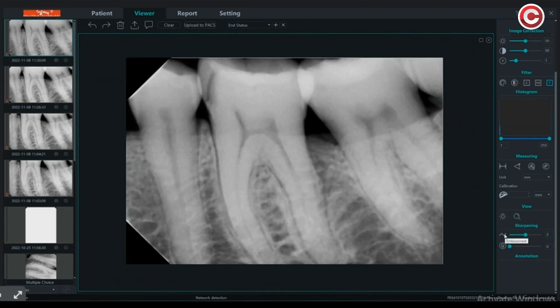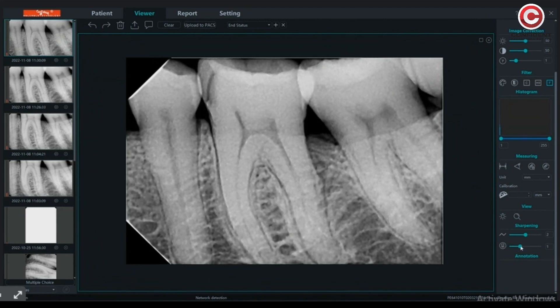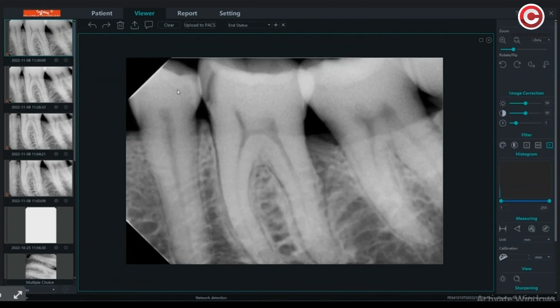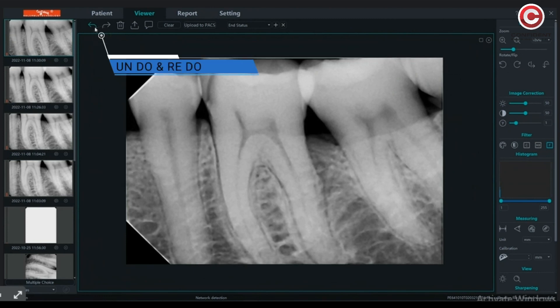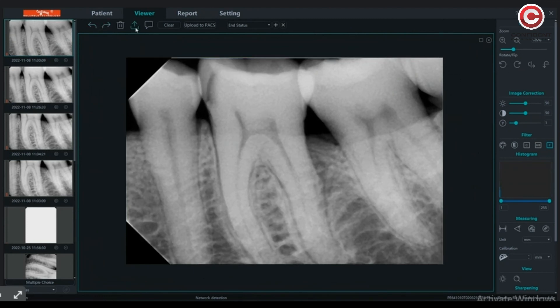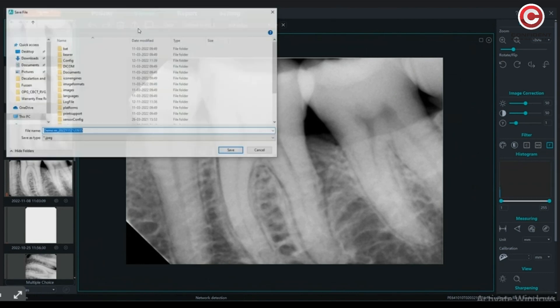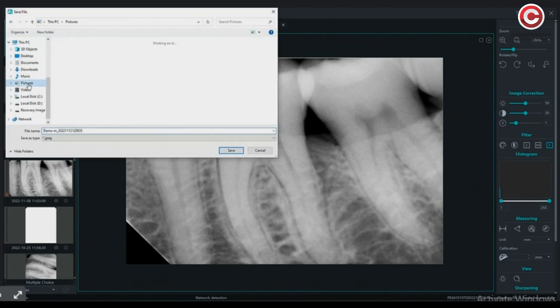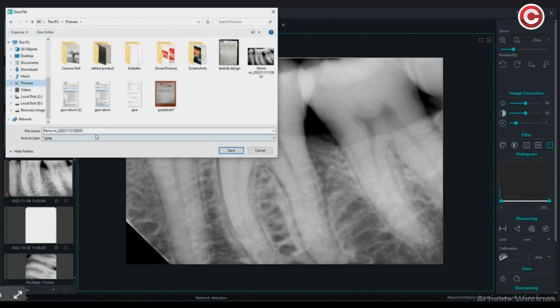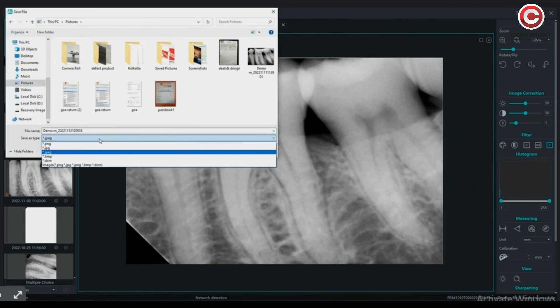By using the sharpening tools, you will have a detailed view of the image. You can undo and redo the changes you have made. Once done, you can export the image to a desired folder in a format of your choice.